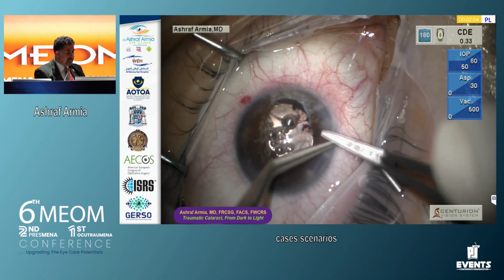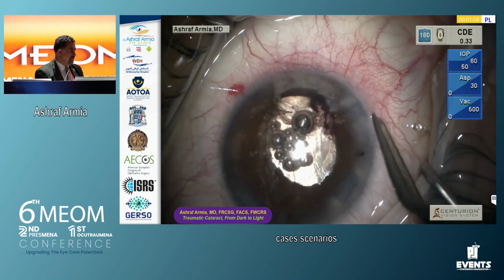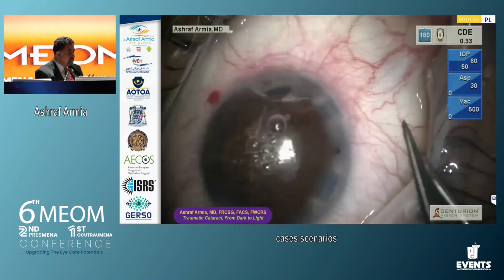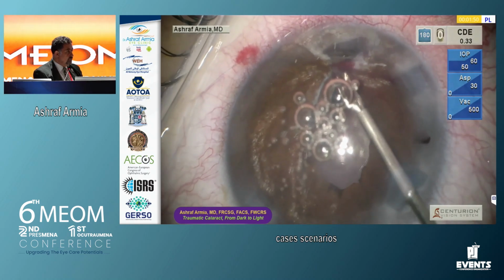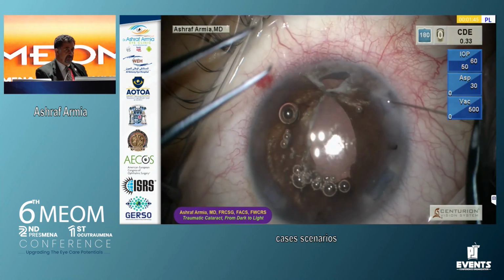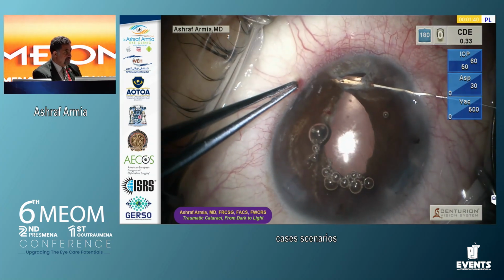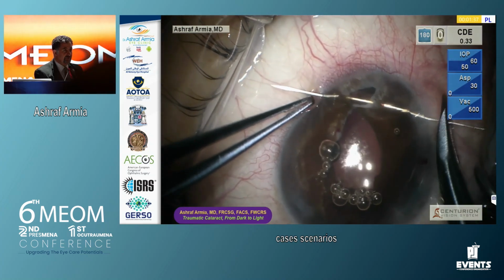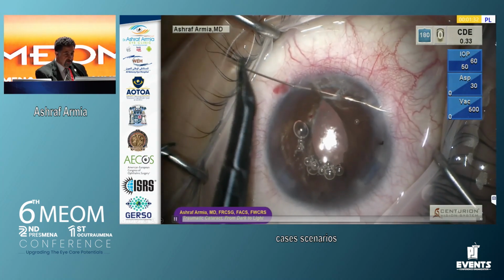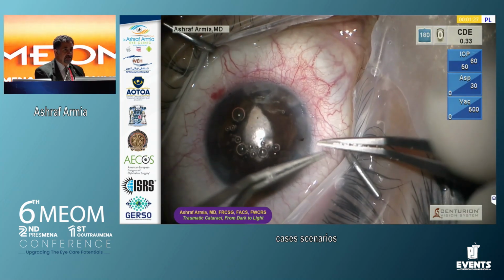This is my technique, 4-throw pupilloplasty by Amar Goral. I think he changed the way of the iris repair. So 4-throw and slowly, just tightening to reach just opposition. Don't do too much, and take as many sutures as you can. You are not supposed to close it completely because there is a fibrous tissue, but try to close as much as you can. But again, never ever overstretch during the iris repair, because the iris in this area is always very weak, and disinsertion easily happens.